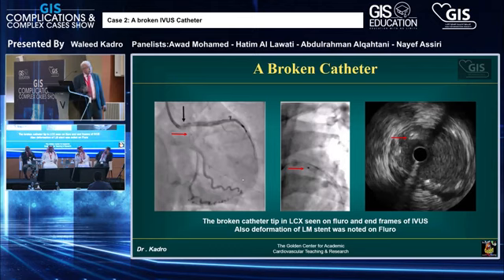Well, I'll tell you what happened. Is the wire still in the circumflex? No, unfortunately, when we were pulling that, the wire came out from the circumflex.